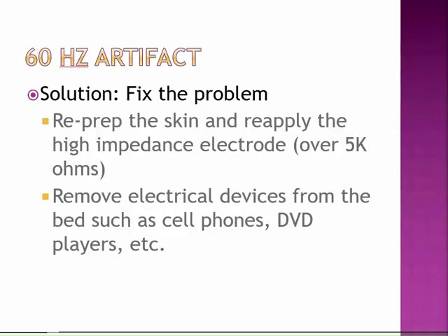Take their phone away. I really love this for patients that will sit on their phone at night and not fall asleep. I'll go in there and say, okay, I've got to take your phone away because it's causing a lot of electrical interference. And it might not always be the cause. Sometimes I'll just pull that line if they're just on their phone and not going to bed, and I want to see them try to go to bed and make use of their time in the sleep lab.